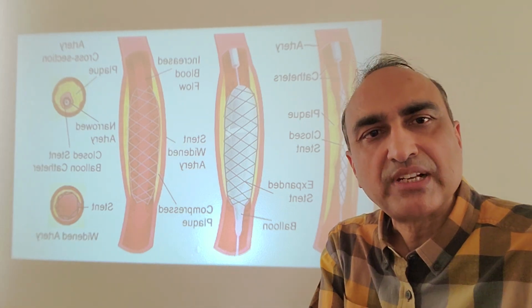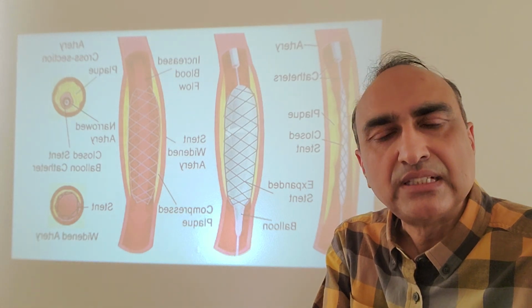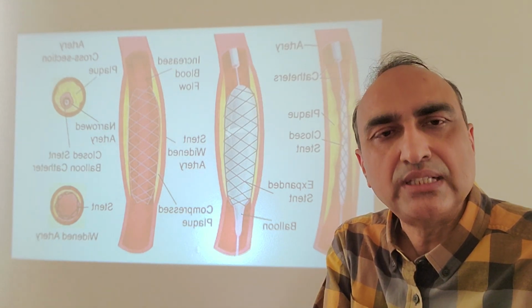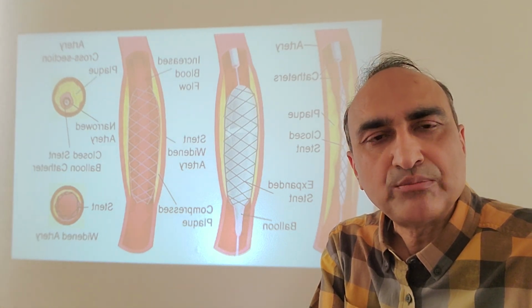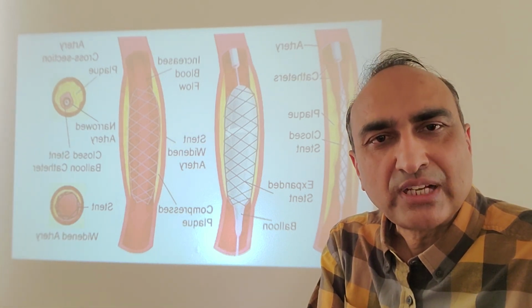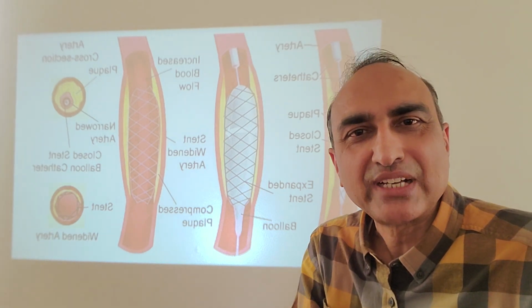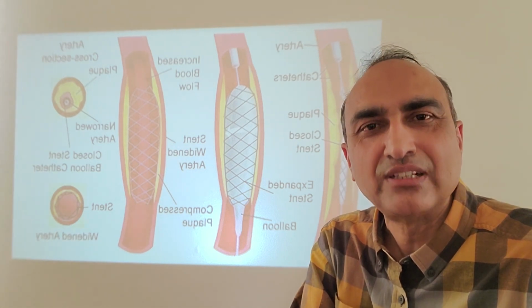The same principle applies if you have blockages in the leg arteries, in the buttock arteries, in the bowel, in the renal or kidney arteries, or wherever they are. We can percutaneously go into those vessels and fix them. And believe it or not, this is some of the magic moments. Once you clear those blockages and the patient feels better, this is a huge and a big relief for all of us.